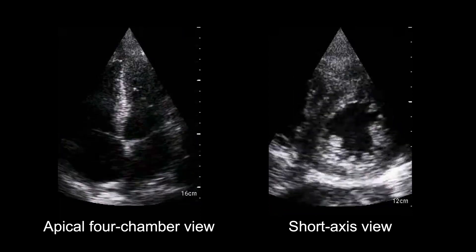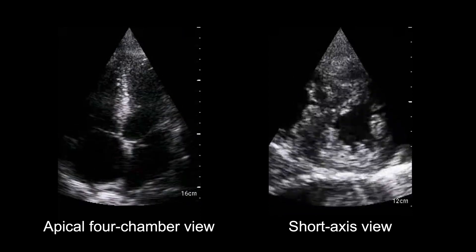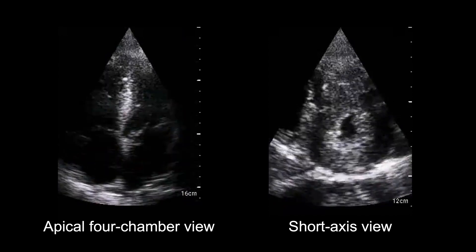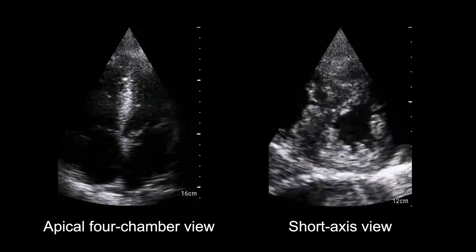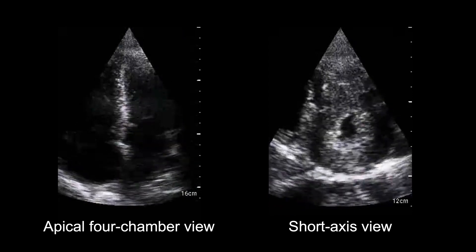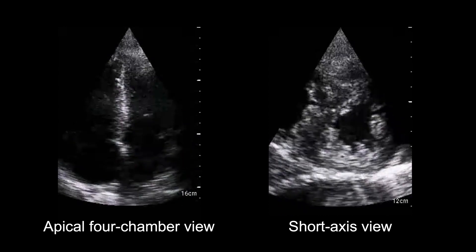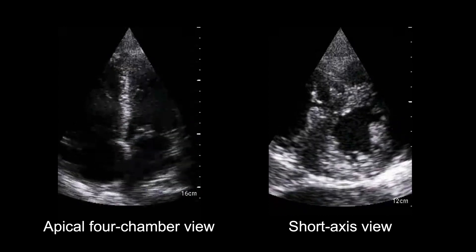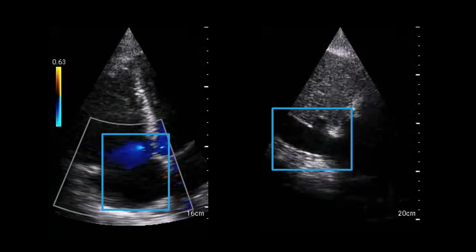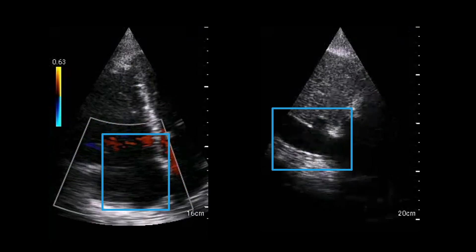As a consequence of pressure overload, since the interventricular septum is a shared structure, the left ventricle may show signs of underfilling as the heart contracts in a confined space. This reduced left ventricular filling may result in the left atrium and left ventricle chambers appearing smaller. Conversely, due to the increased right ventricular afterload, right atrial pressures increase with resulting tricuspid regurgitation and a dilated, non-collapsing inferior vena cava.